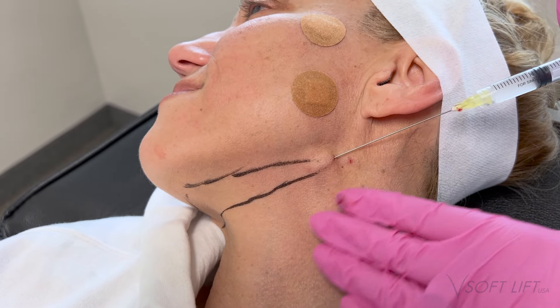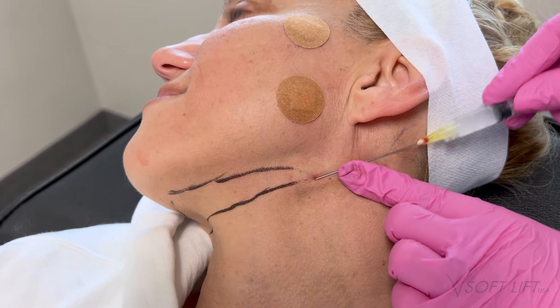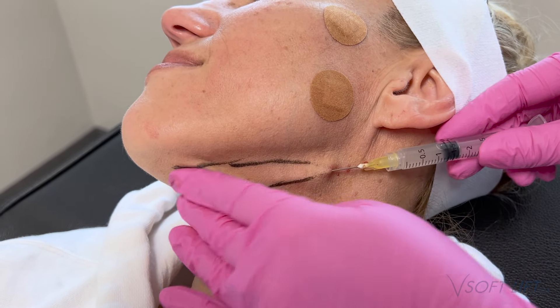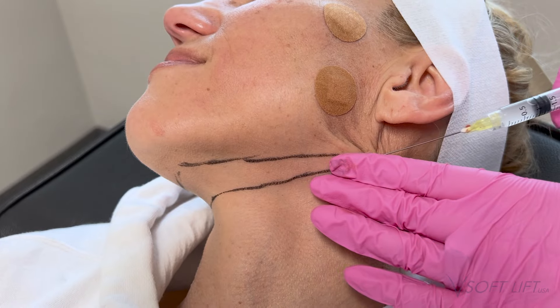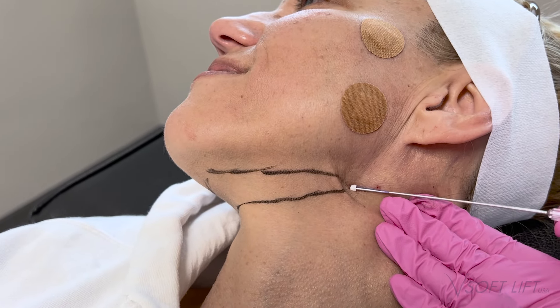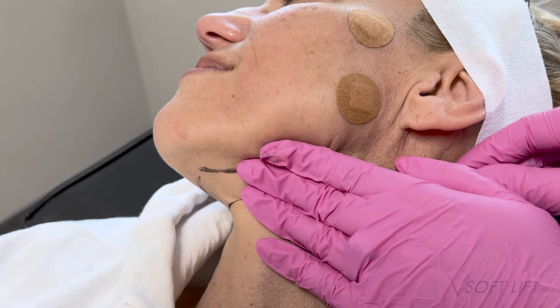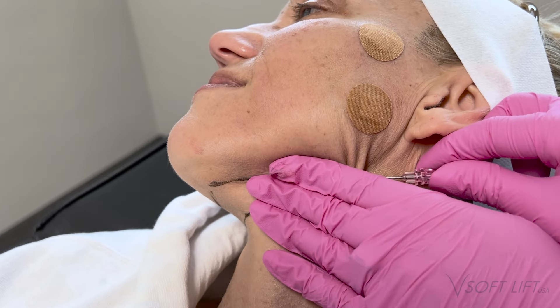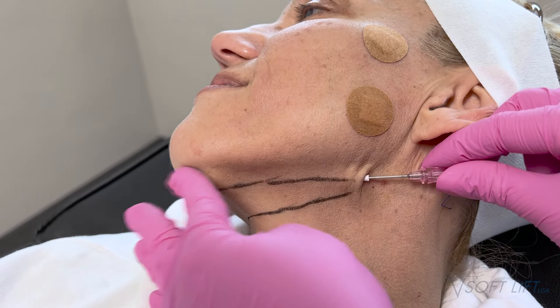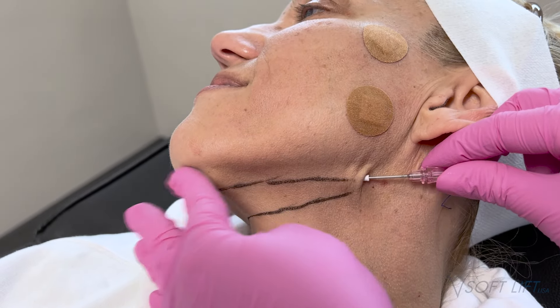Moving on to neck threads. Once you get the hang of threads, they are very easy — it just takes time getting used to the feeling. Once you have cannula use down, they're simple to place. In the neck it looks like I'm a little more superficial since she has very thin tissue, but I'm happy with the placement. I know we won't be able to see the thread. This is also a great introduction to cannula use if you're not already using cannulas for filler, as threads are a very cannula-heavy treatment. Here we're going in with 18-gauge threads, following the same process.